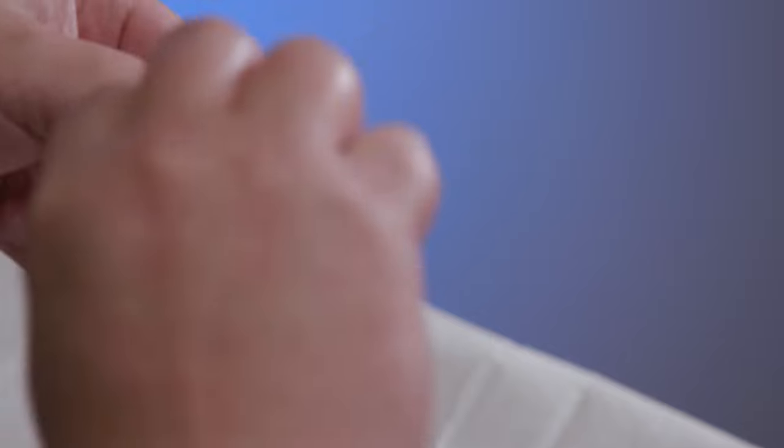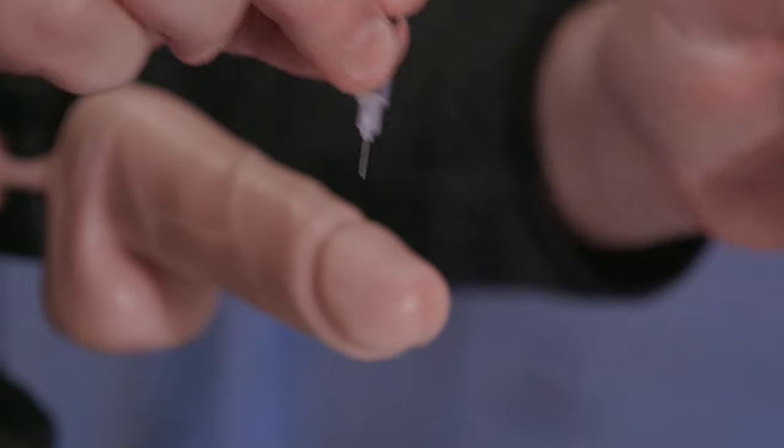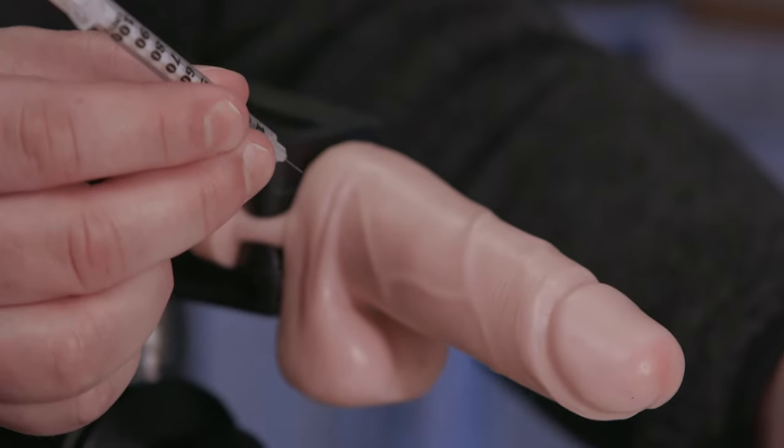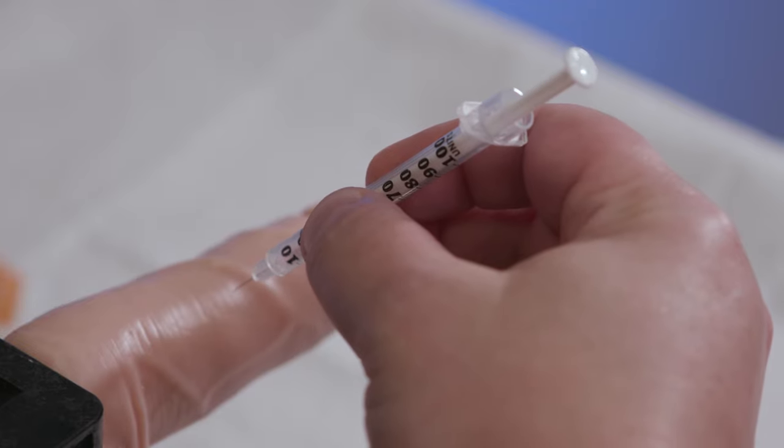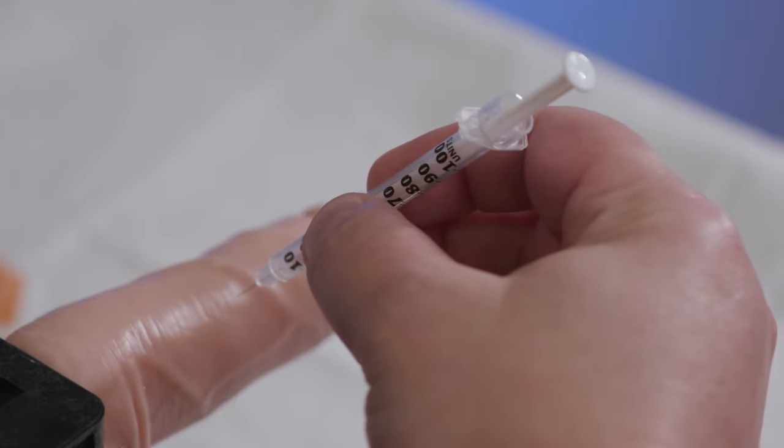Hold the syringe between your thumb, index, and middle fingers, like you'd hold a pen or dart, with the needle facing the floor. Don't touch the plunger yet.